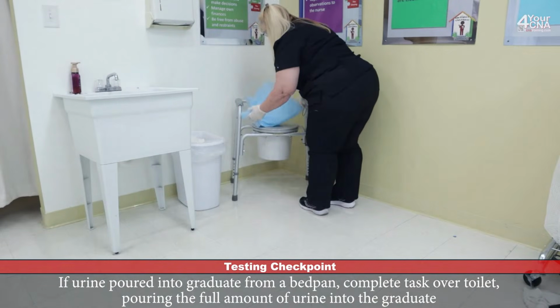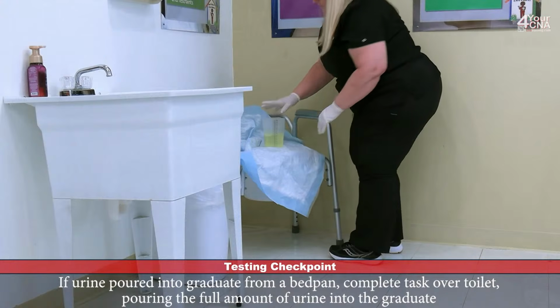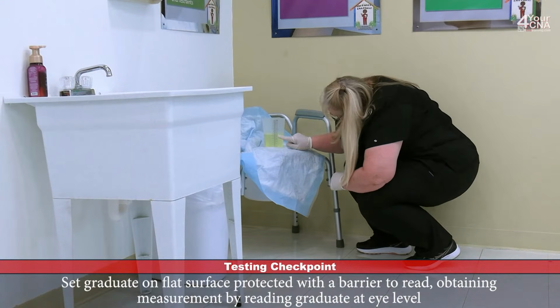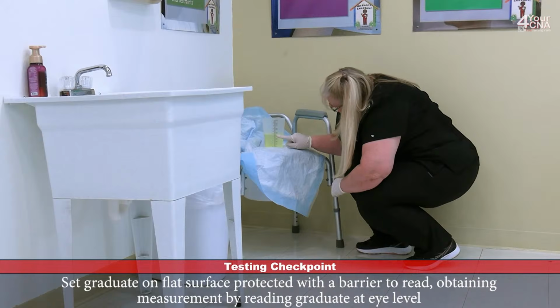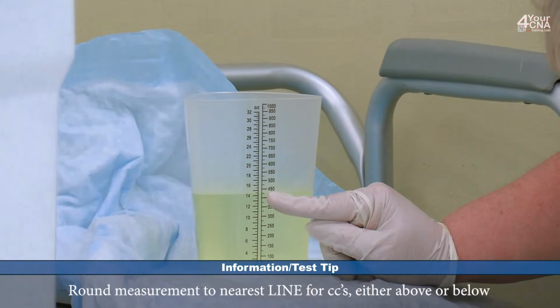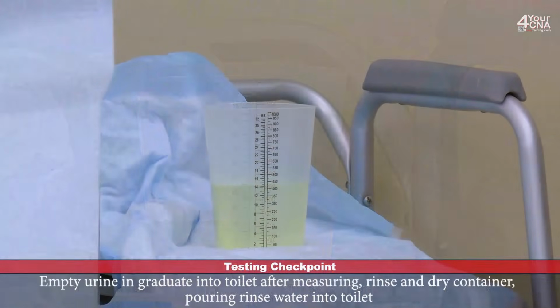We're going to set it down on the lid of the bedside commode and unwrap it, turning the cup around so that we can read the amount of urine that's in the cup. We need to be at eye level. It needs to be on a flat surface and on a barrier. I'm going to throw the chucks away.